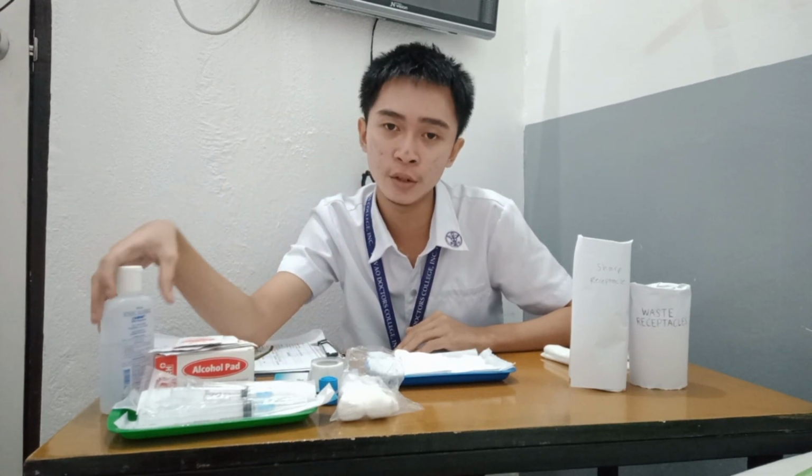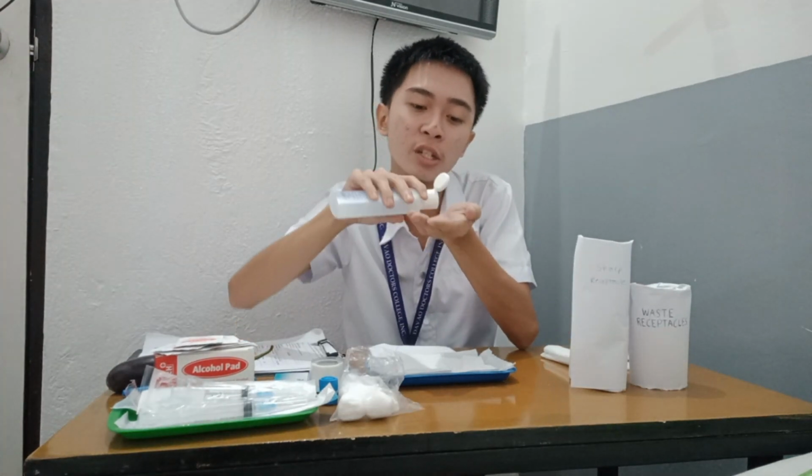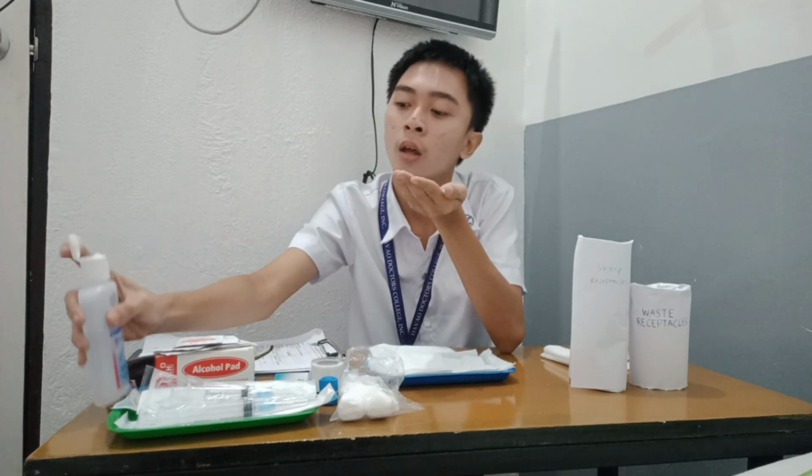Preparing medications from ampules. So now I'm going to proceed with the preparation of medication in an ampule. So this is what an ampule looks like. Perform hand hygiene and observe the appropriate infection prevention procedures, to deter the spread of microorganisms.